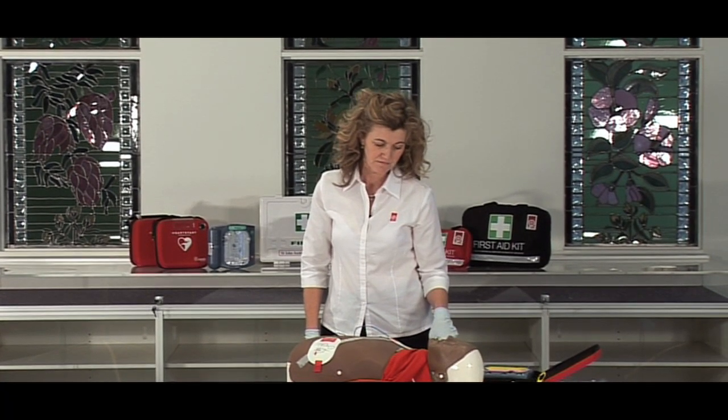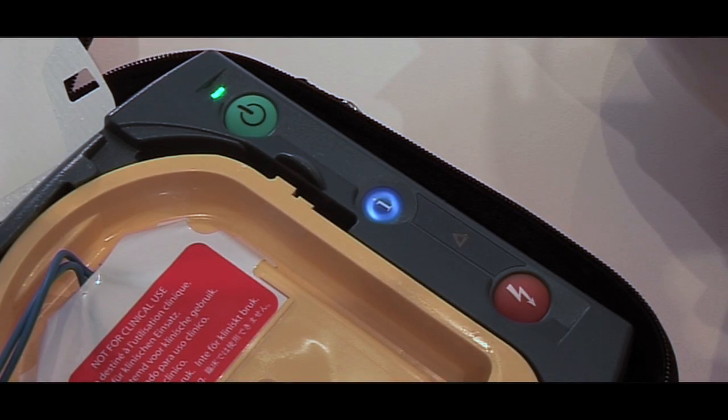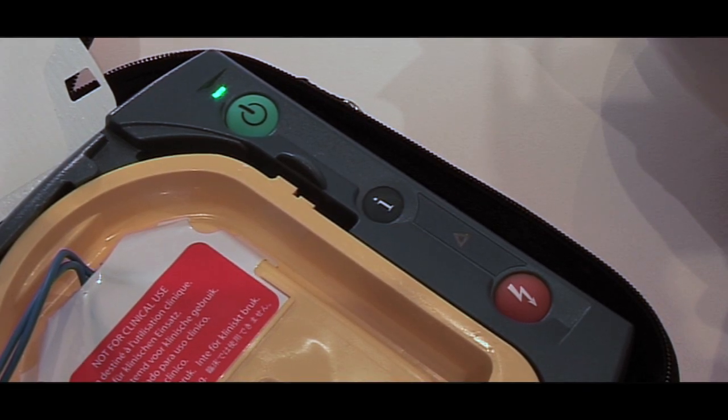Be sure the ambulance service has been called. It is safe to touch the patient. Start CPR. For help with CPR, press the flashing blue button.